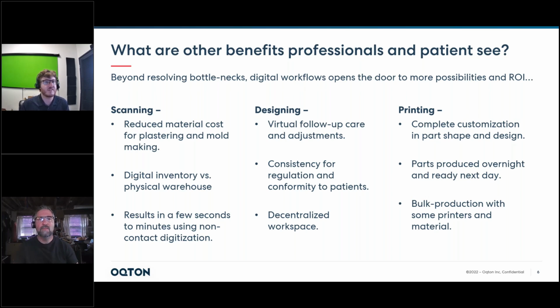And again, we're breaking this up into categories because this technology fits into different realms. We're not necessarily replacing traditional methods, but we're trying to assist with it and make life a little easier. And again, when it comes to scanning molds, it's easier to send them out, you're reducing certain costs, and so you get ROI and more automation and more possibilities.